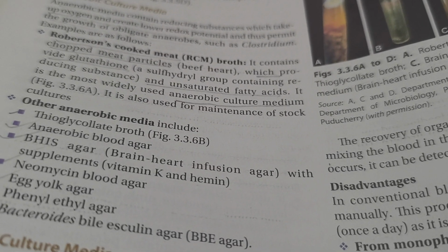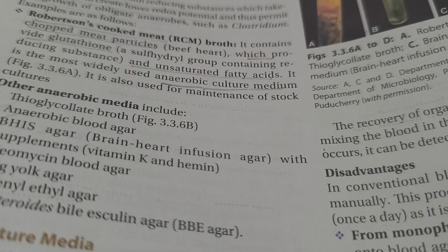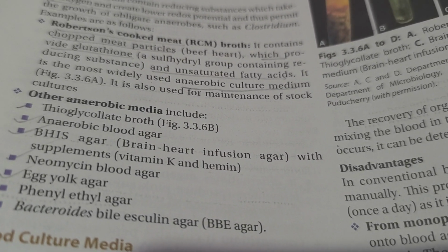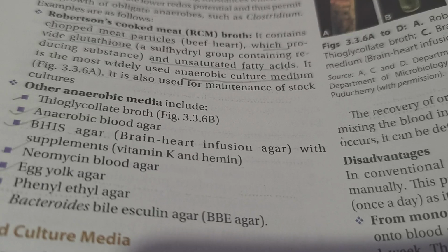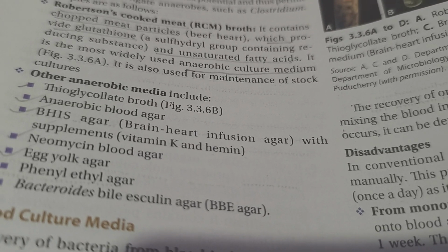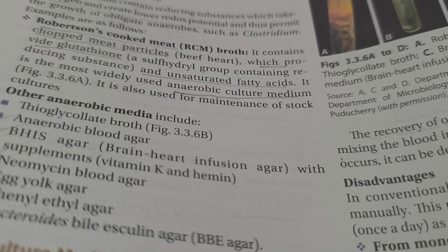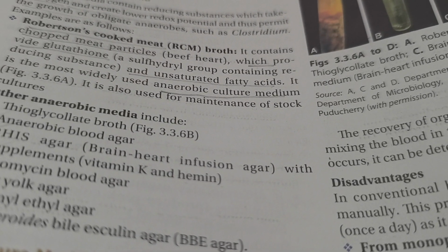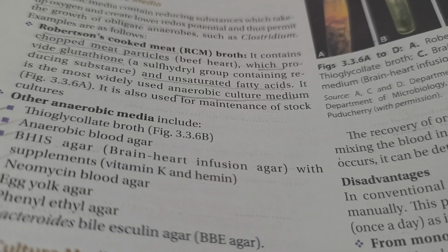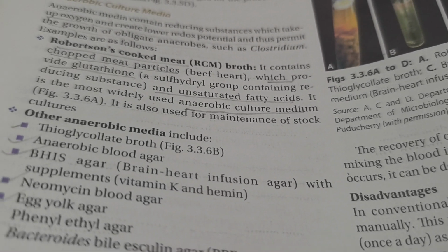It contains chopped meat particles, beef heart, which provide glutathione, a sulfhydryl group containing reducing substance, and an unsaturated fatty acid. It is the most widely used anaerobic culture media. It is used for maintenance of stock cultures.